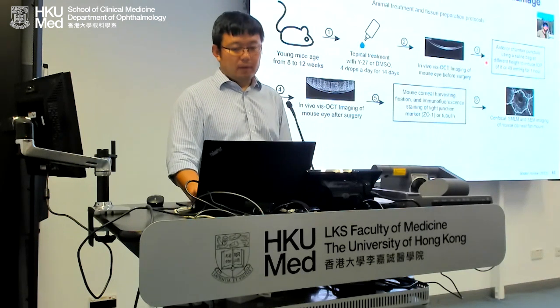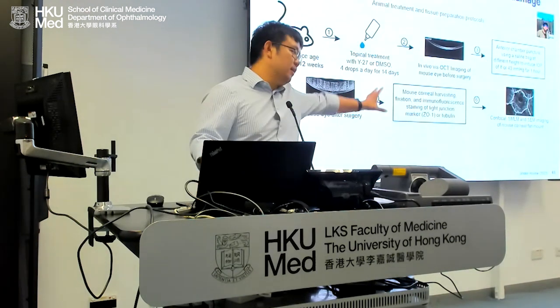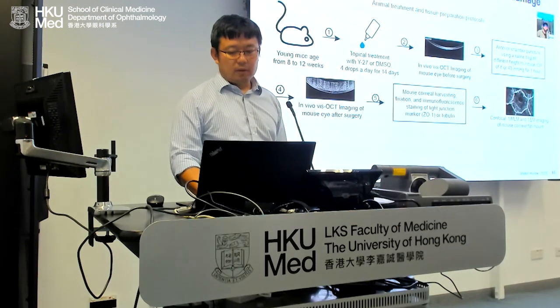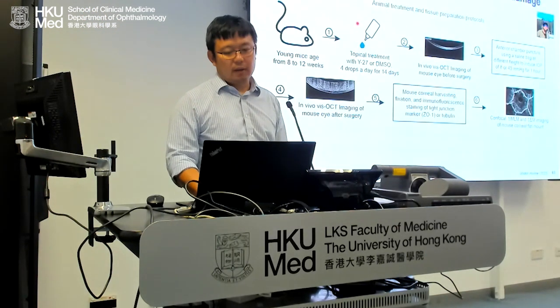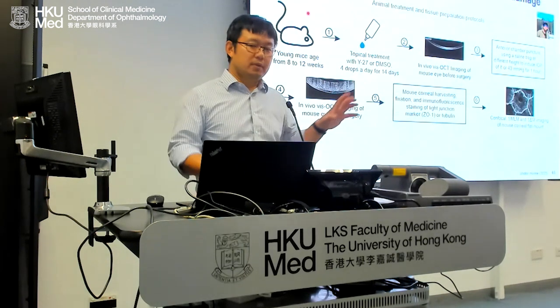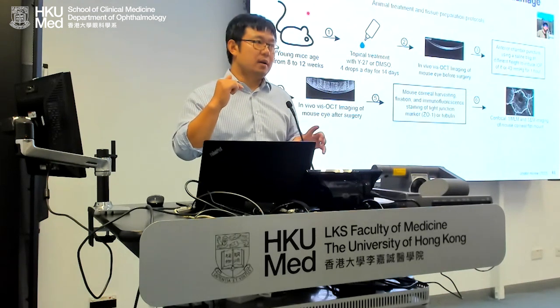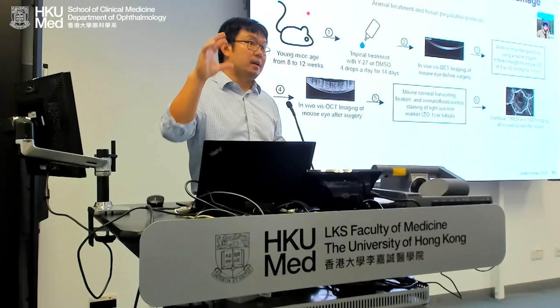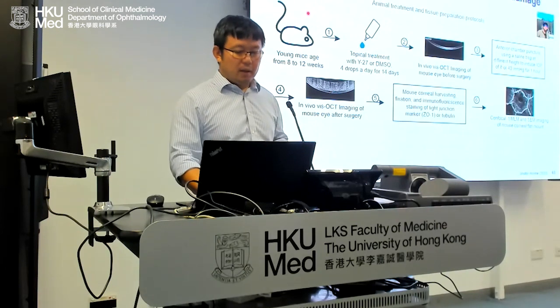One last example. So multi-scale, all right? I talk about OCT, I talk about super resolution. What do I mean by multi-scale? So this is a corneal damage study. What we did is we take control mouse and we take mouse that we artificially increase the intraocular pressure. So it's a hypertension model, but it's an acute hypertension model.